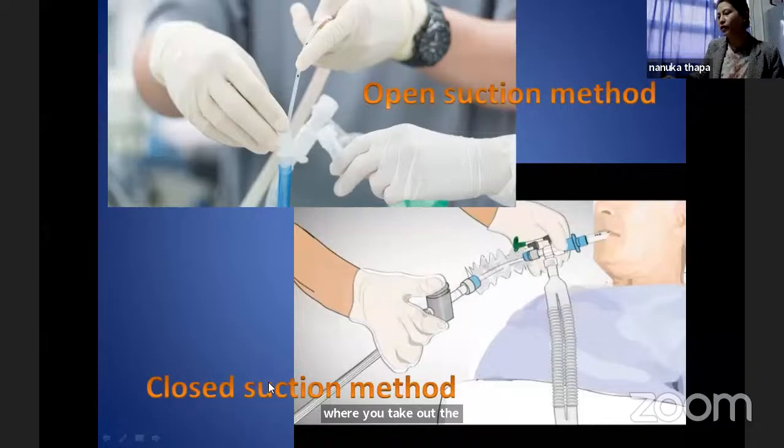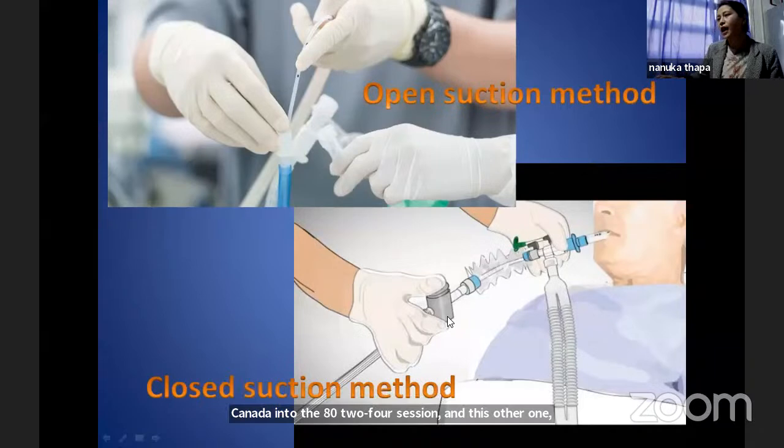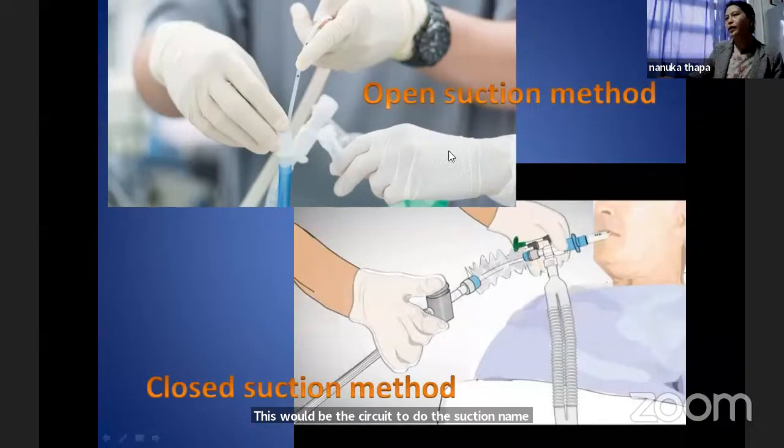And this other one, as you can see in this picture, is a closed suction method where you can wear clean gloves, and you don't need to disconnect the ventilator circuit to do the suctioning, okay? So all of you know how to operate the open and closed suction?